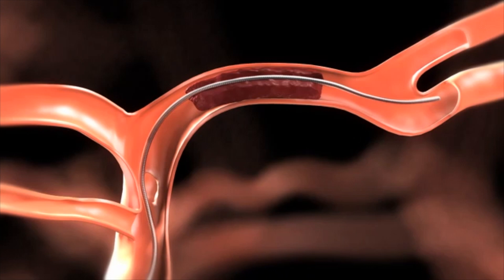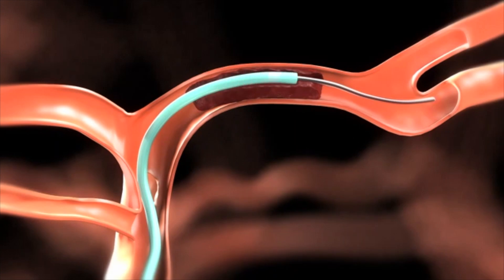With the aid of a suitable guide wire, hold the guide wire in place and advance the micro catheter. Position the micro catheter distal to the thrombus so that the usable length portion of the solitaire FR will extend past each side of the thrombus when fully deployed.